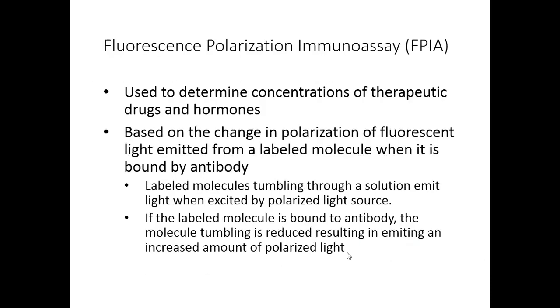I'm going to spend 2 seconds on fluorescence polarization immunoassay. It can be used for things clinically, drug monitoring, concentration of drugs and hormones that are present in a patient. It's also used in food stuff identification. So, there's limited use within a routine clinical lab for this. Fluorescent polarization immunoassay has the unfortunate acronym of FPIA.